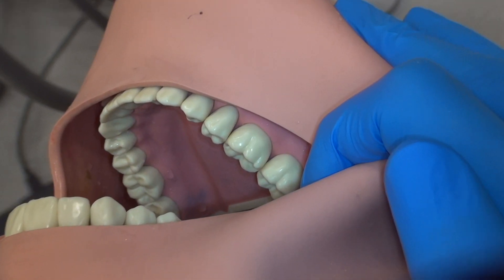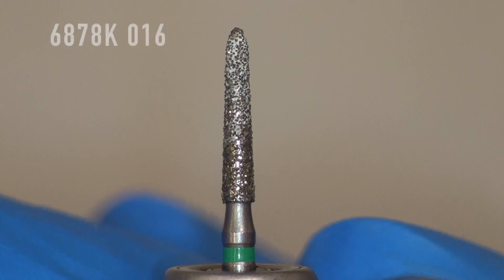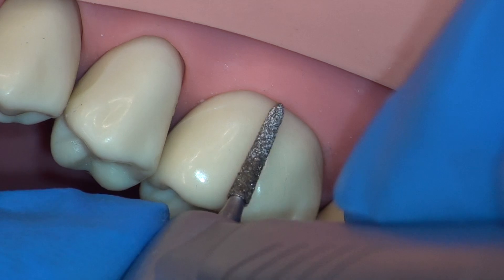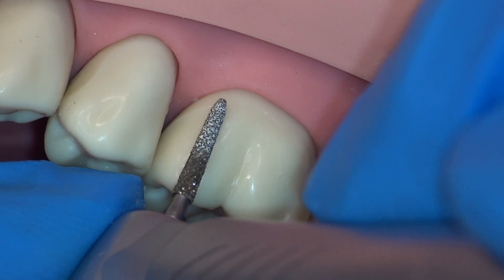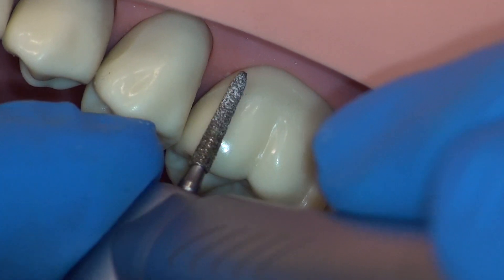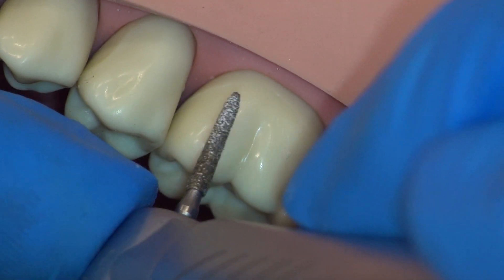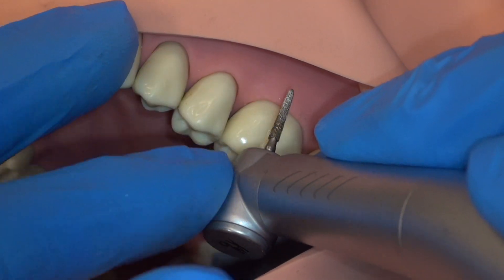We'll begin preparation from the buccal view by turning the patient's head to the left. We begin with a coarse chamfer burr. Throughout preparation, it is important to consider the rotation direction of the burr. This rotation direction can be changed on the control screen for an electric handpiece. Whenever we are cleaving large amounts of tooth structure, we do not want the burr to be rolling with the direction that we are moving. Using a finger rest on each hand, use your left hand to support the handpiece.